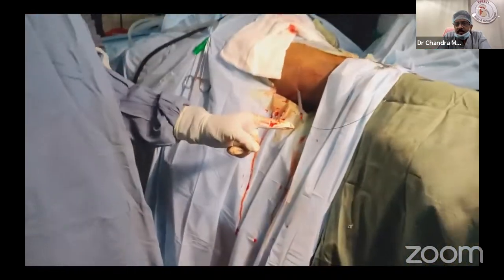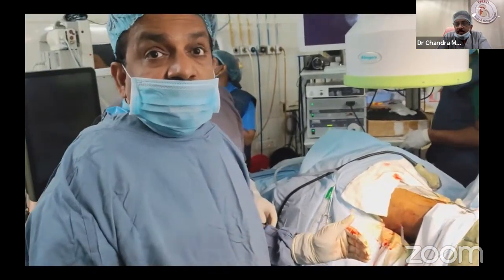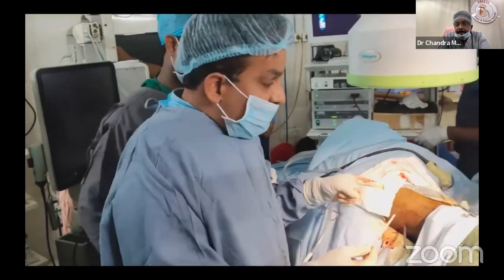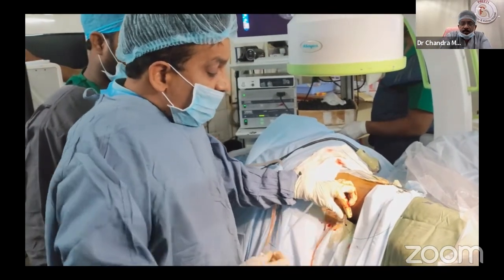See, it is coming out. Saline. Mild hematuria, no problem. Let us see how it is inside, whether the infundibulum and the periphery of the calyx are there or not. Very important: when he is pushing, you can suck it out without removing the guide wire.